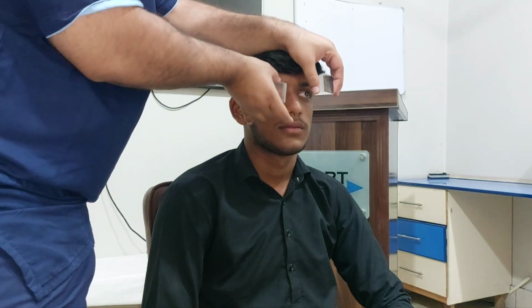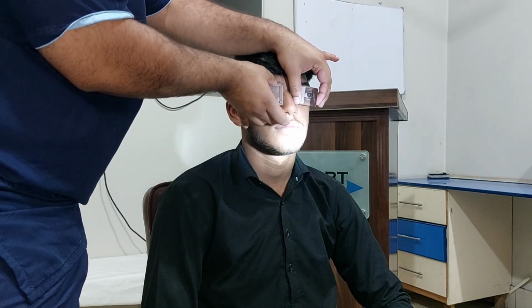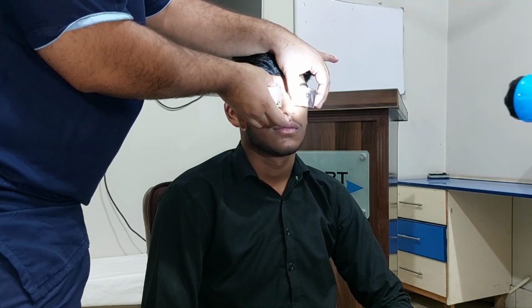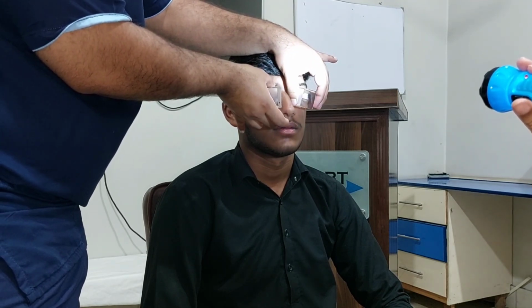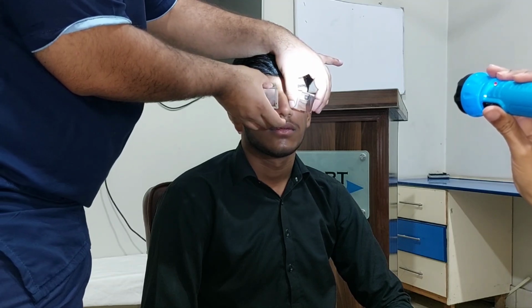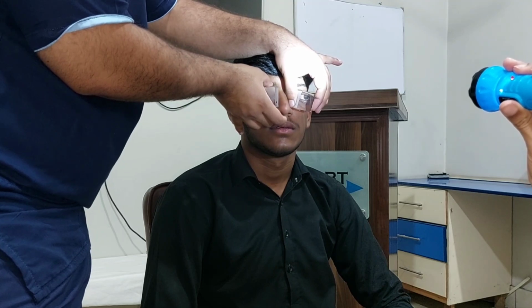So in Krimsky test, you are increasing the power of the prism to a point where you see the corneal reflections are in the center. So this can be done in the non-cooperative patients in which you cannot perform the cover uncover test.